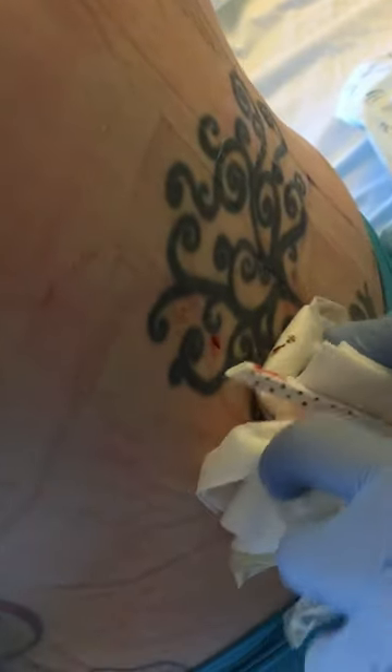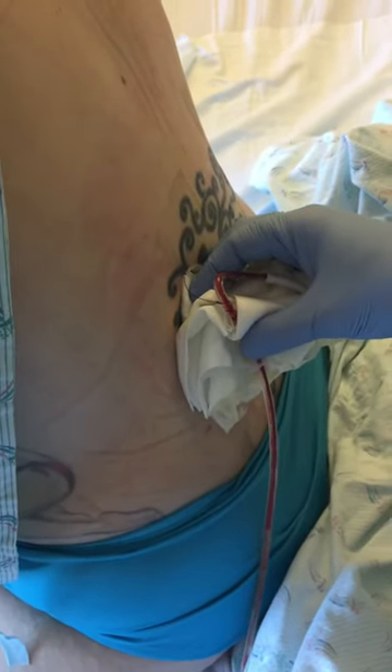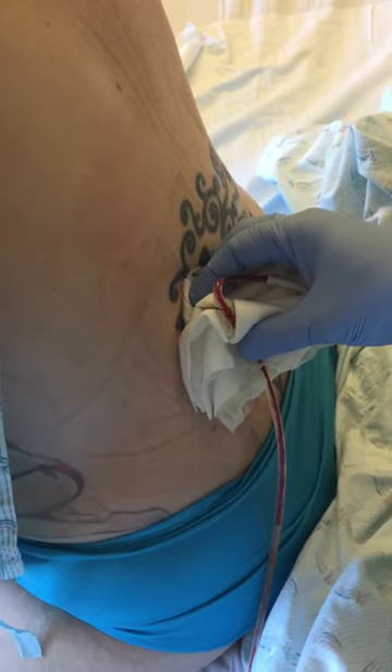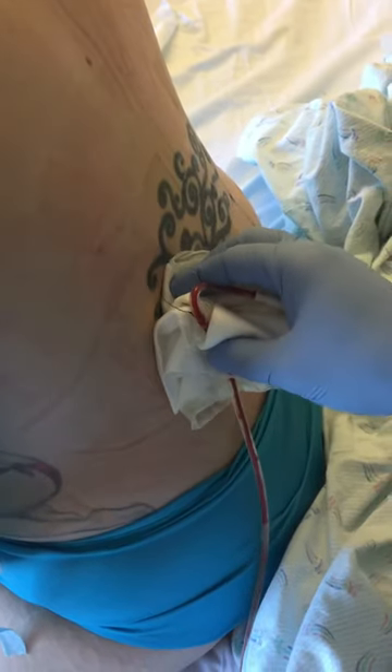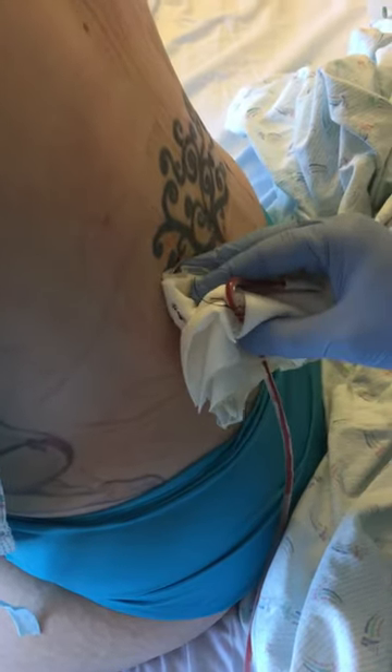Almost done. Done. It did — so weird. Yeah, super weird. I bet. All right, looks good. Incision looks good. All right, so that's it.